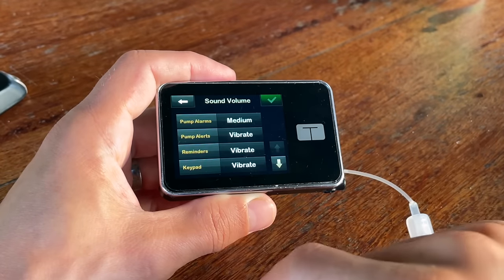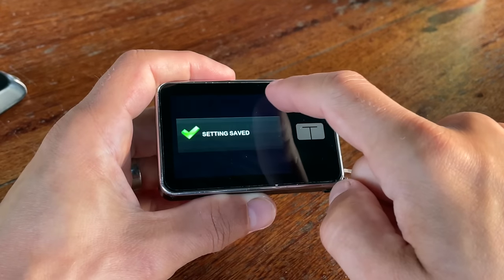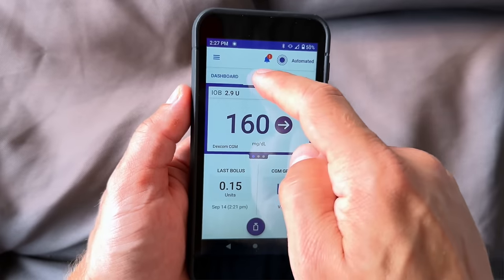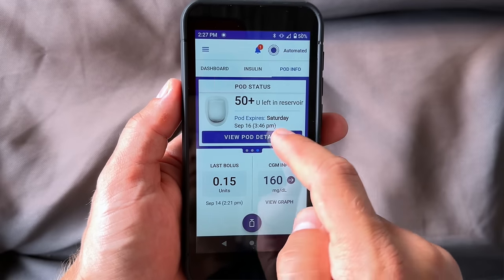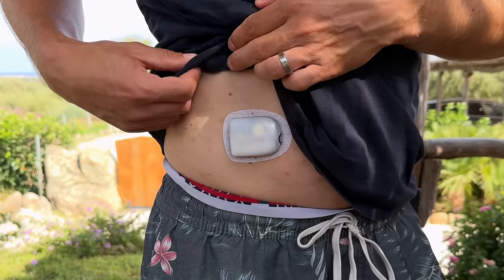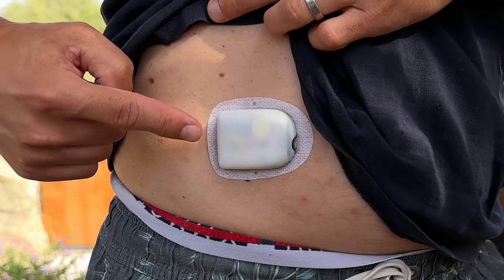I personally like to look at my blood sugar quite often. One more thing about the T-Slim X2 — the display is really good looking and the touchscreen is very responsive, but you simply get a better touchscreen experience with the Omnipod 5's controller or smartphone. What's really cool about the Omnipod 5 is that the algorithm resides inside the pod itself, so even if you forget your controller at home the pod will still adjust your basal insulin based on how your blood sugar is trending — you just won't be able to bolus or change settings without the controller.